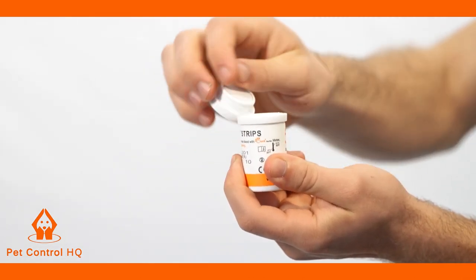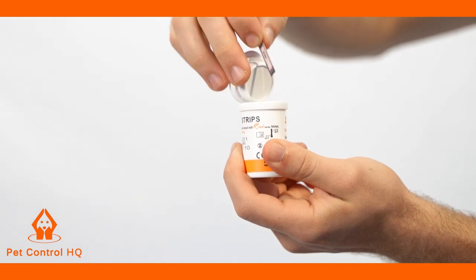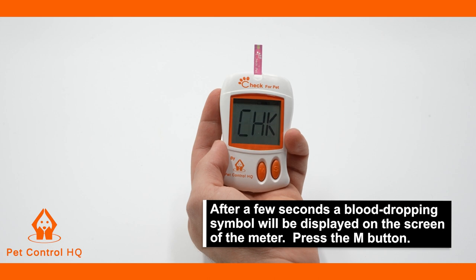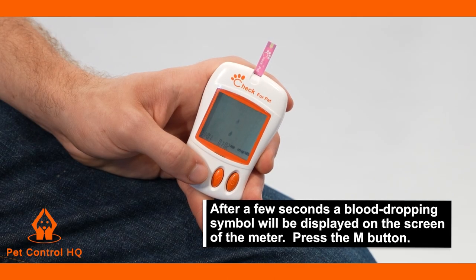You will need to insert a test strip into the test port of the PetControl HQ blood glucose meter. Once inserted, after a few seconds a blood drop symbol will be displayed on the screen of the meter.